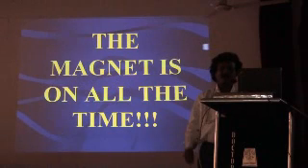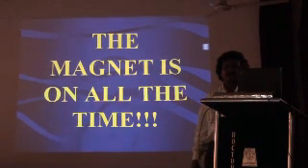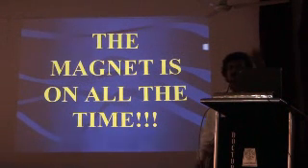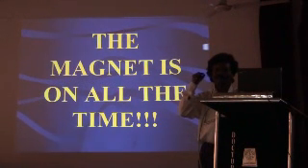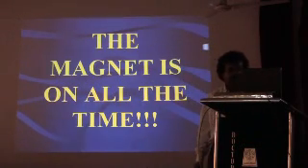And to suppress the noise, we introduce a music system, but it causes disturbance in the radio frequency pulse and causes artifact. That's why, and it is costly. But most of the time, we put earplugs in the patient, and the patient can tolerate those noises.